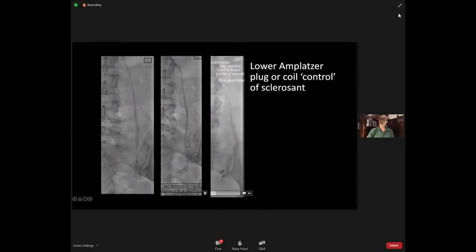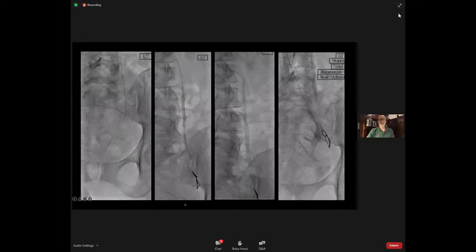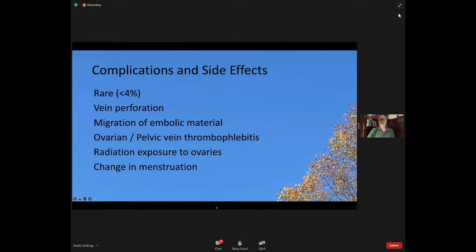And as you can see, I'm laying out the sodium tetradecyl in this left ovarian vein, and it's filling the vein very nicely. It's staying where it is because of our coil assisted protection here, and it's not flowing out the top of the ovarian vein. And another example of coil assisted protected sclerotherapy of that ovarian vein. So we're trying to avoid flooding that pelvic venous plexus.